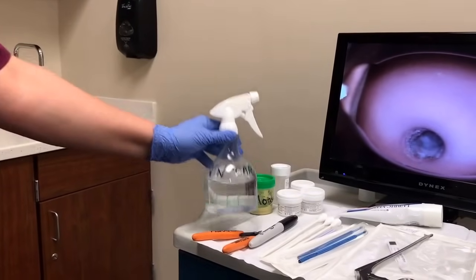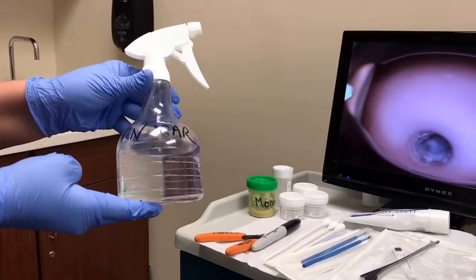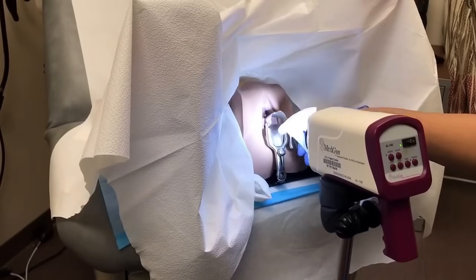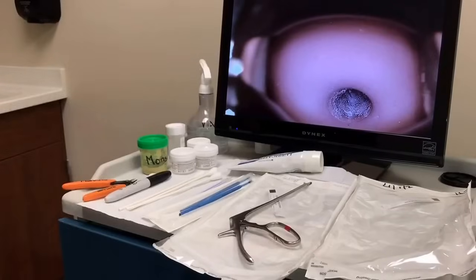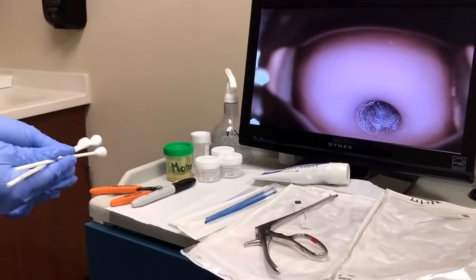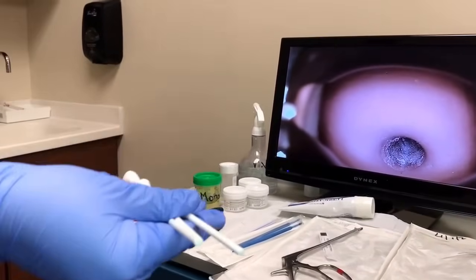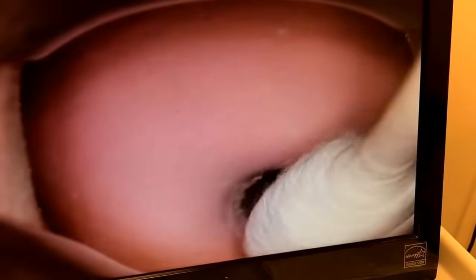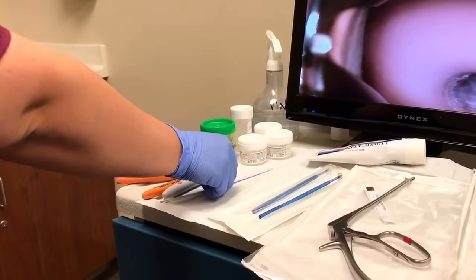After the provider has placed the speculum, the MA will grab the vinegar solution and hand it off to the provider. After the vinegar solution has been sprayed onto the cervix, the MA will give the provider three GYN swabs. After the vinegar solution has been placed, the provider will grab the swabs, soak up any of that solution, and disperse it onto the cervix.